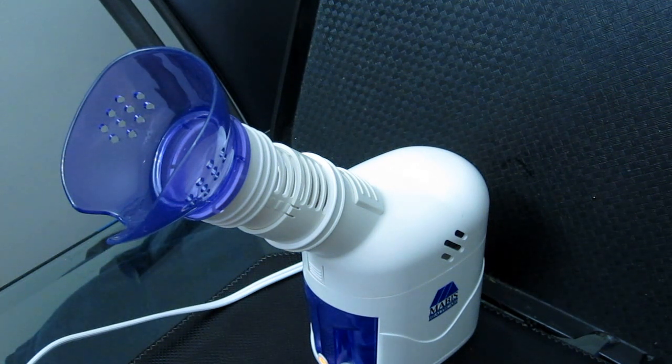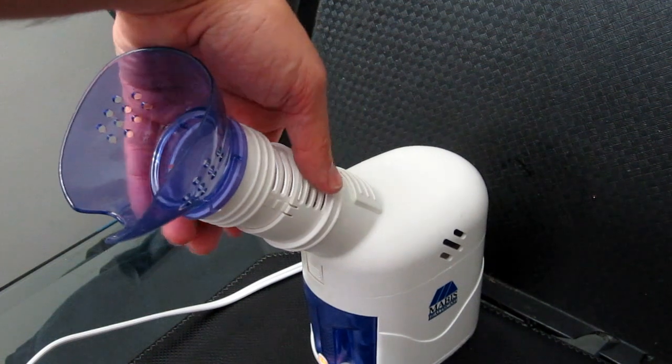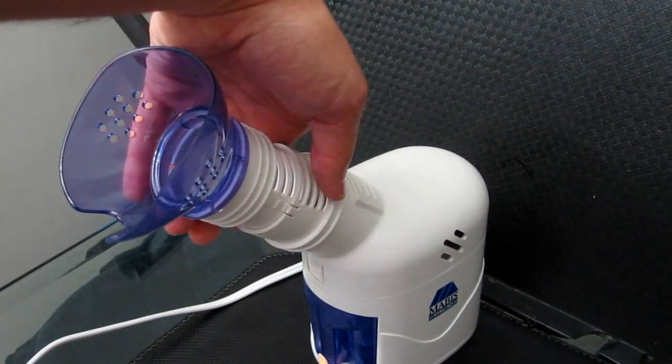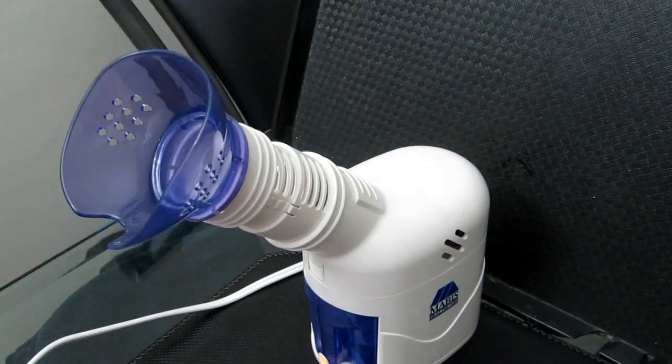Anyway, I don't know how many minutes it's been, but it definitely takes a couple minutes to heat up. And then it lasts, I would say, 6 or 7 minutes. I'm not going to keep you guys on hold here while it happens, but I'll just wait till it starts coming out so you can see it again.